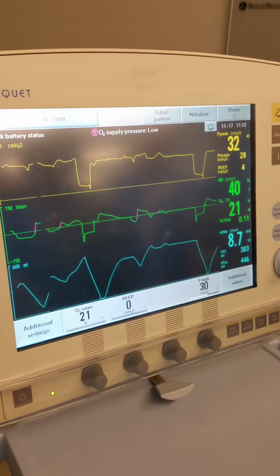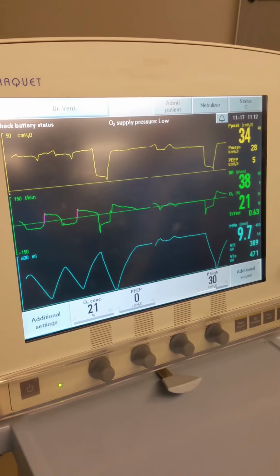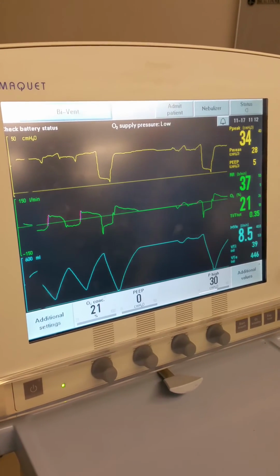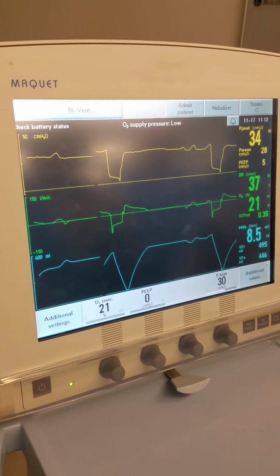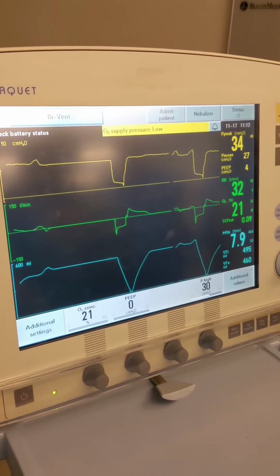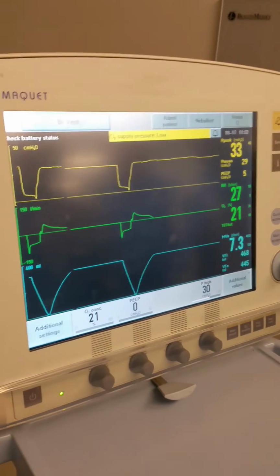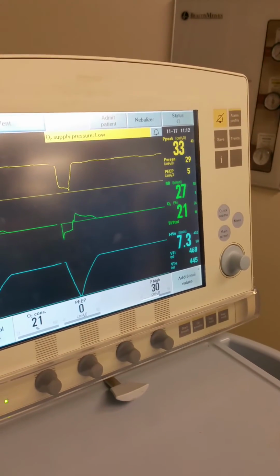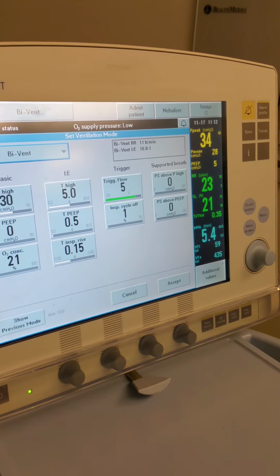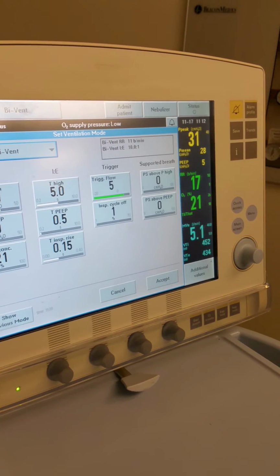So how about if I drew a CO2 and now I'm having a problem with CO2. Let's say that my CO2 came back and was now 65 and the physician wants to get it lower. You want to increase your T low so you have more expiratory time. Decrease? So think about that. Let's go back to the screen. If I want to blow off more CO2, what do I want to do?